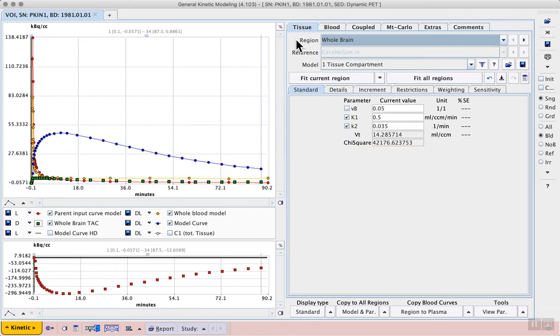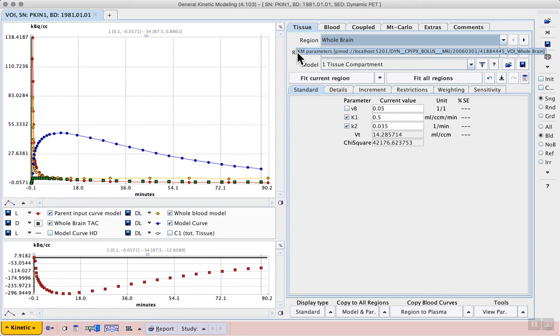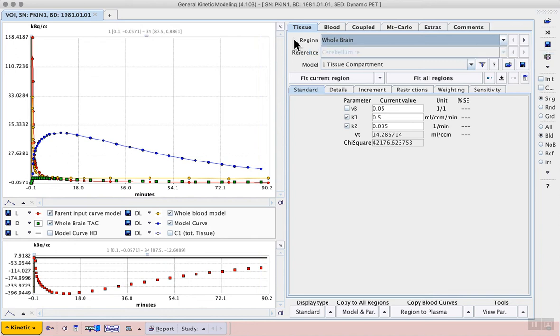On the tissue tab we can select an appropriate brain region to start the modeling process. Although whole brain would seem like a good average of all the time activity curves, it might also be a mix of grey matter and white matter.